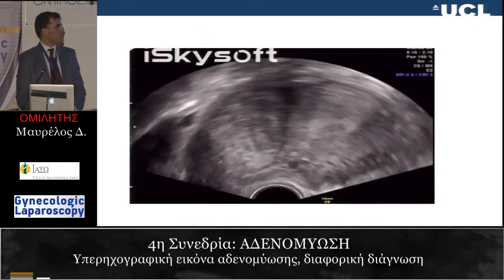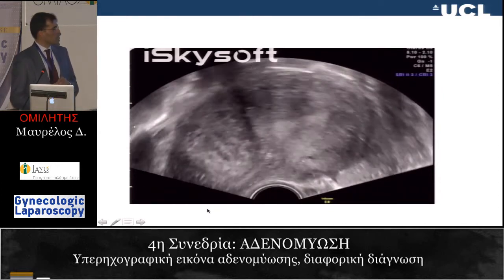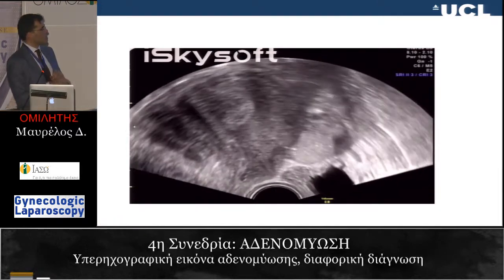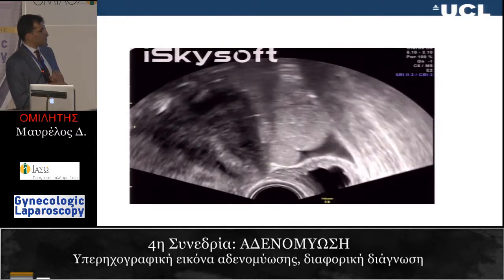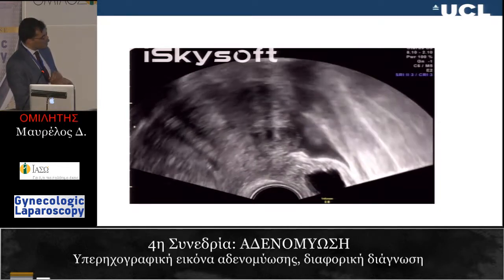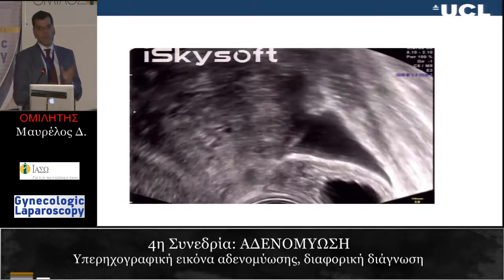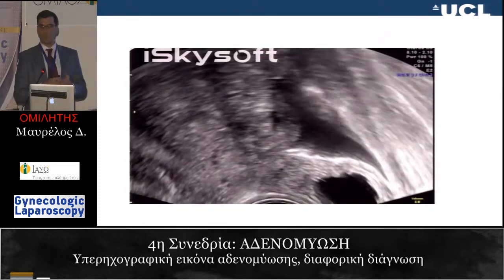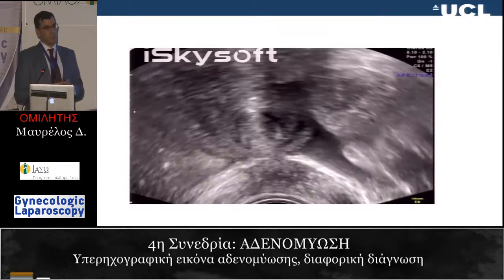And I'm going to leave you with a video because I like this one. So this is basically a woman who has a full panoply of gynecological disorders. She has a fibroid, she has adenomyosis, and then you'll see that she has a bladder nodule that comes from the adenomyosis. So as to whether you need an MRI, I think if you are an experienced scanner with a high-quality machine and you know what you're looking for, you can diagnose any endometriotic nodule quite reliably.